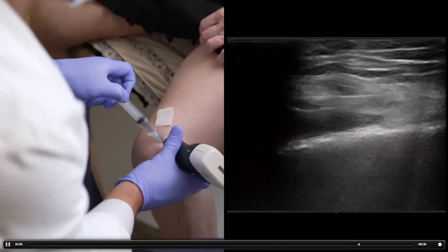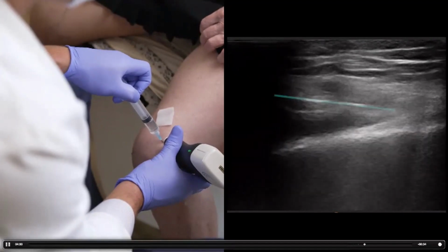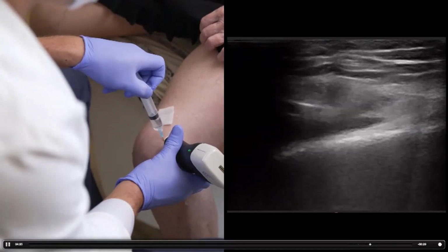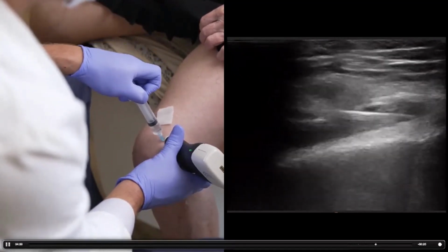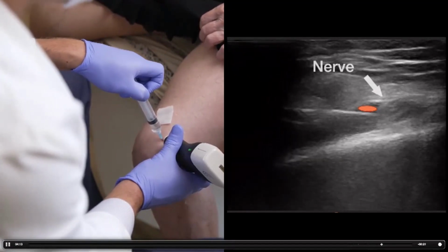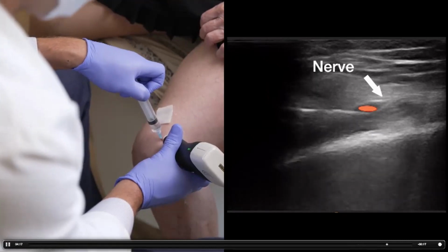Top of the artery, and I'm going to get the needle slightly lower. Anesthetize the nerve underneath it. There we go. That's it. That's the nerve right above my needle. The artery's to the left of it. Much easier to see after the local anesthetic has been given.